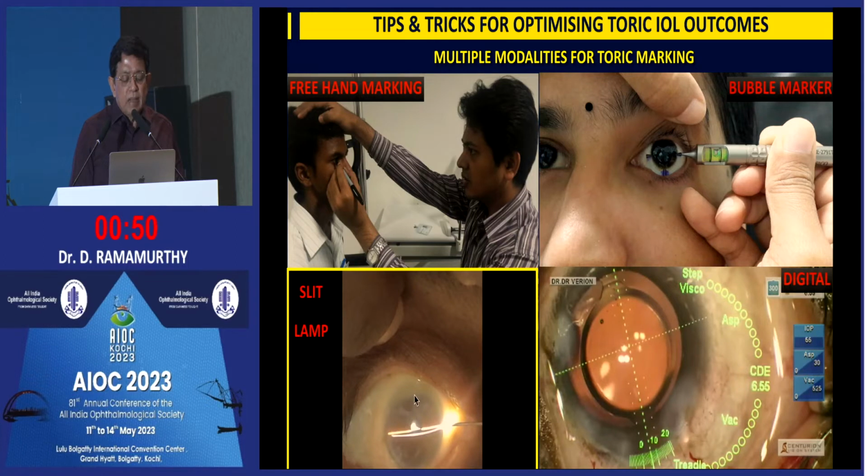Otherwise, if you do not have access to a digital marking device, then use a slit lamp before the pupil is dilated, creating a slit cutting across the pupil. I usually use a 26 gauge needle to mark, creating a small subconjunctival hemorrhage there, which will not disappear during the surgery.